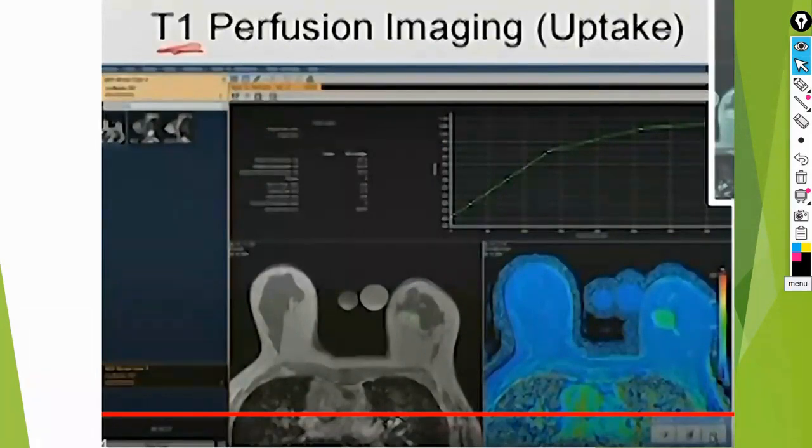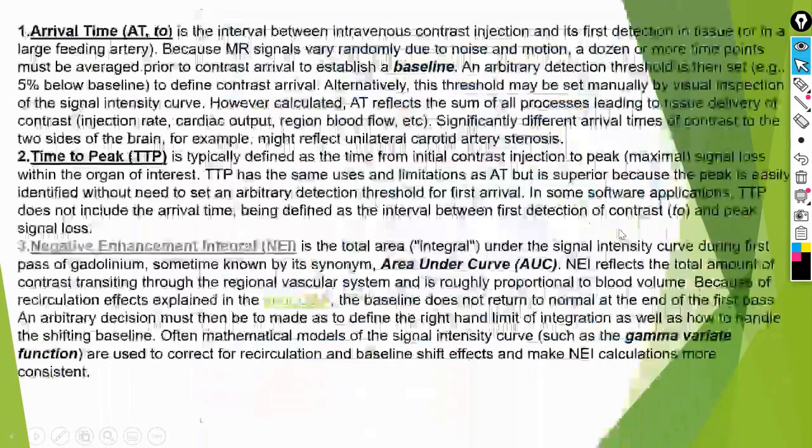So would the curve go up or down? God bless you. So now, why is it high? Because at this time, the decrease in T1 means that the MZ is high, which means that the signal is more bright. That's why the signal is more bright for the signal we benefit from T1.